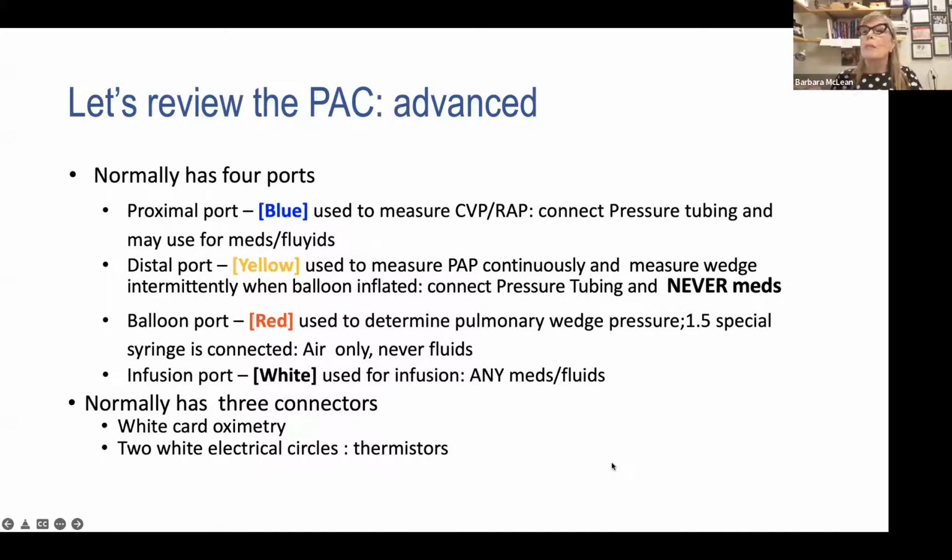At the distal tip of the PA catheter, about 0.5 centimeter below the distal tip, there is a balloon. And when you inflate that balloon, the catheter will sail forward into the arteriole, occluding everything from behind it, looking only forward, and ultimately looking forward means reaching the left ventricle. So that port is only used intermittently, and in many institutions, my own included, in general, nurses do not inflate balloons, and we do not read those pressures, wedge pressures. We are going to use a more indirect surrogate, and that's known as the PA diastolic pressure.